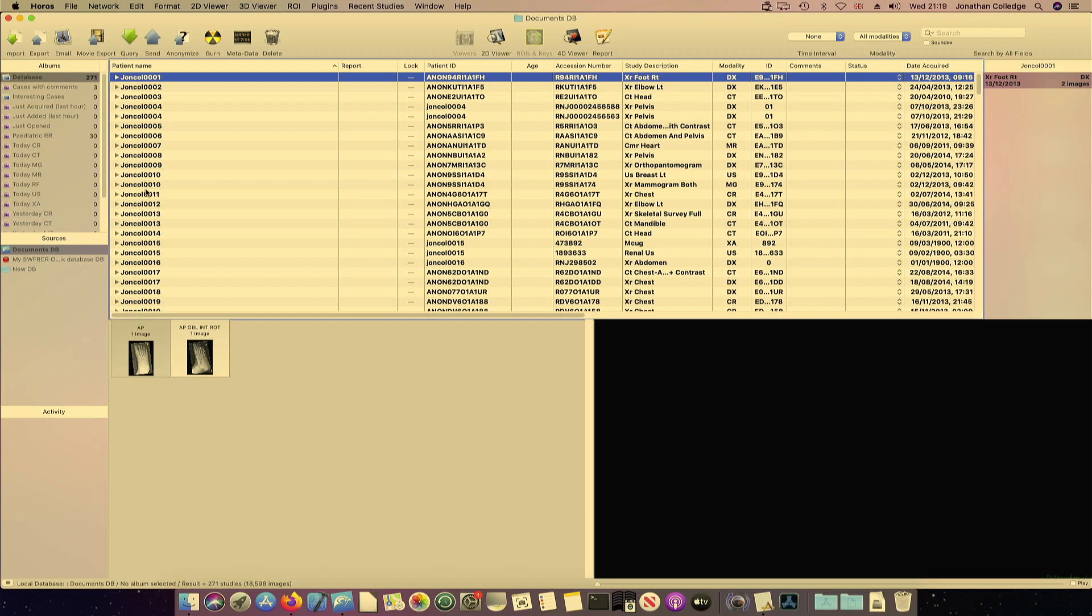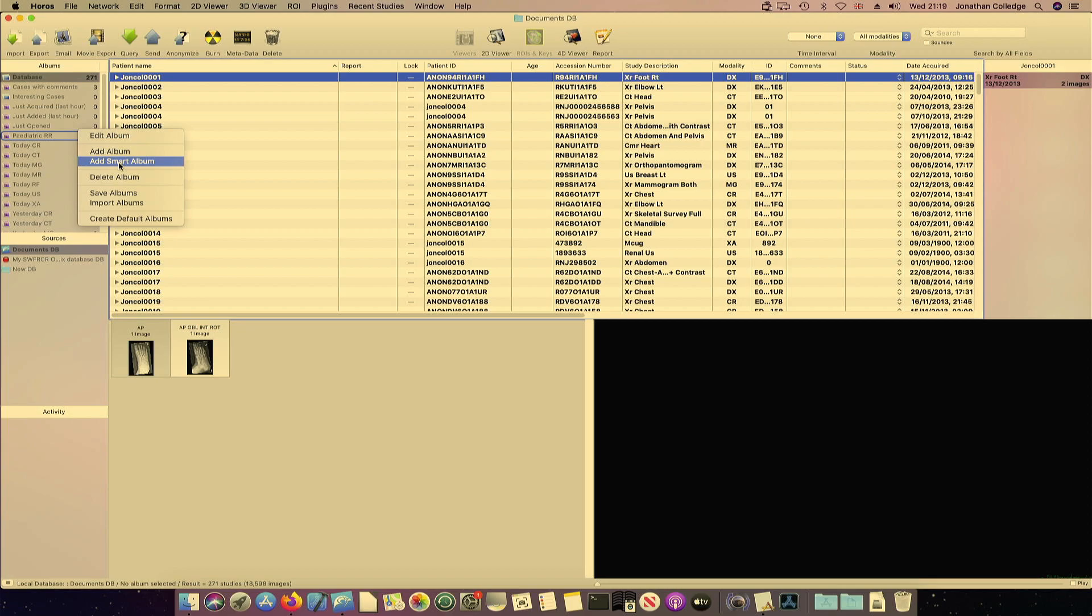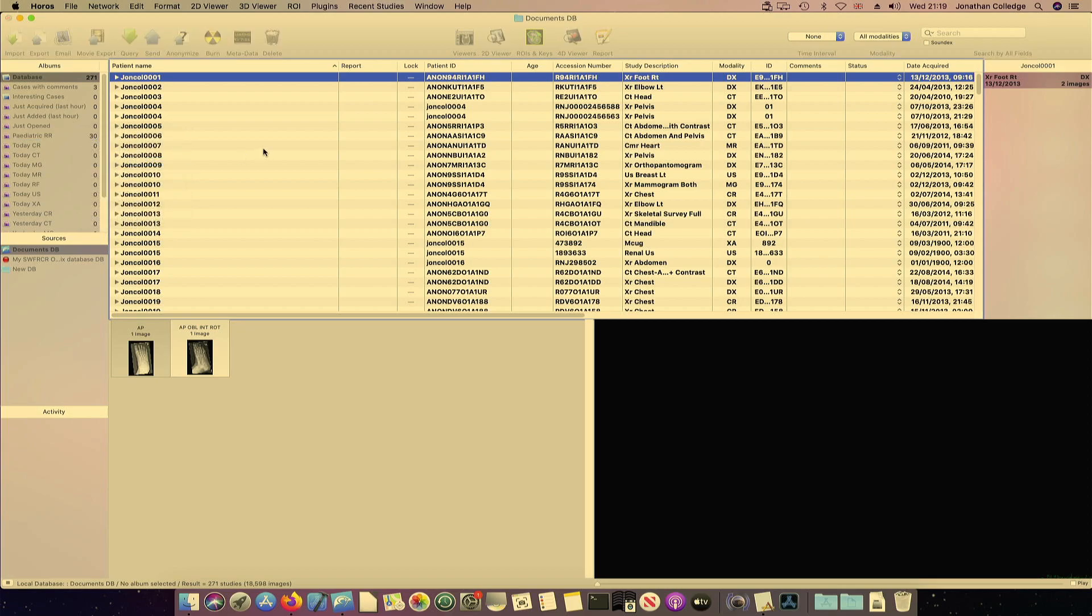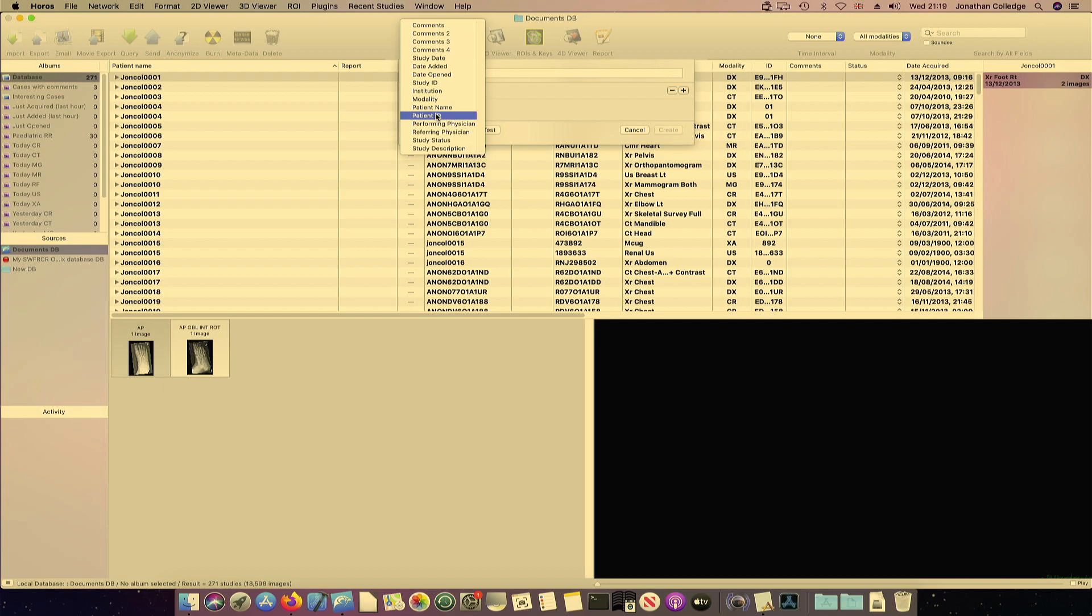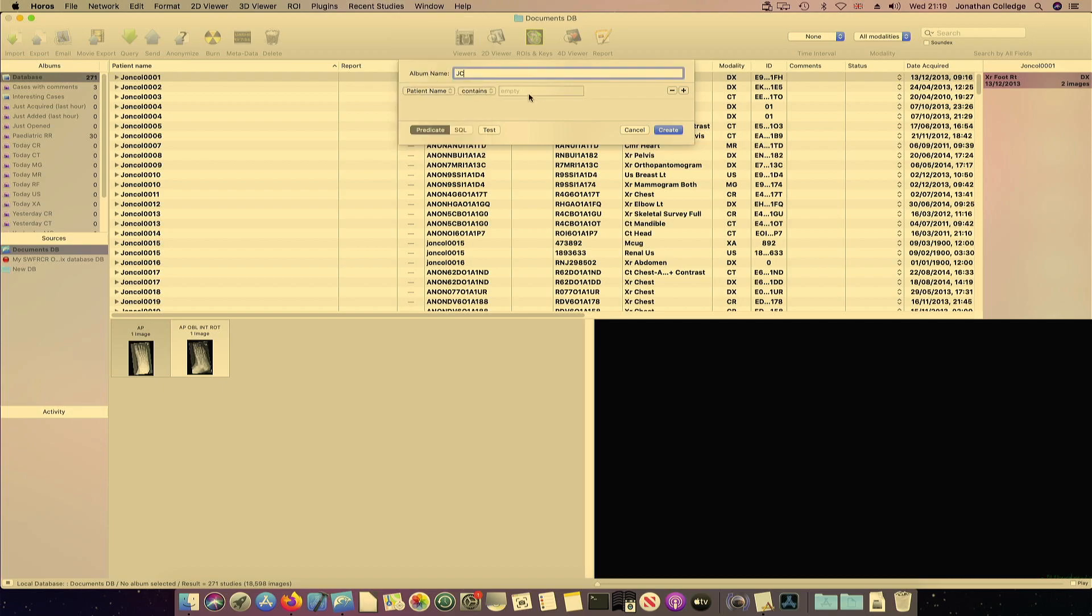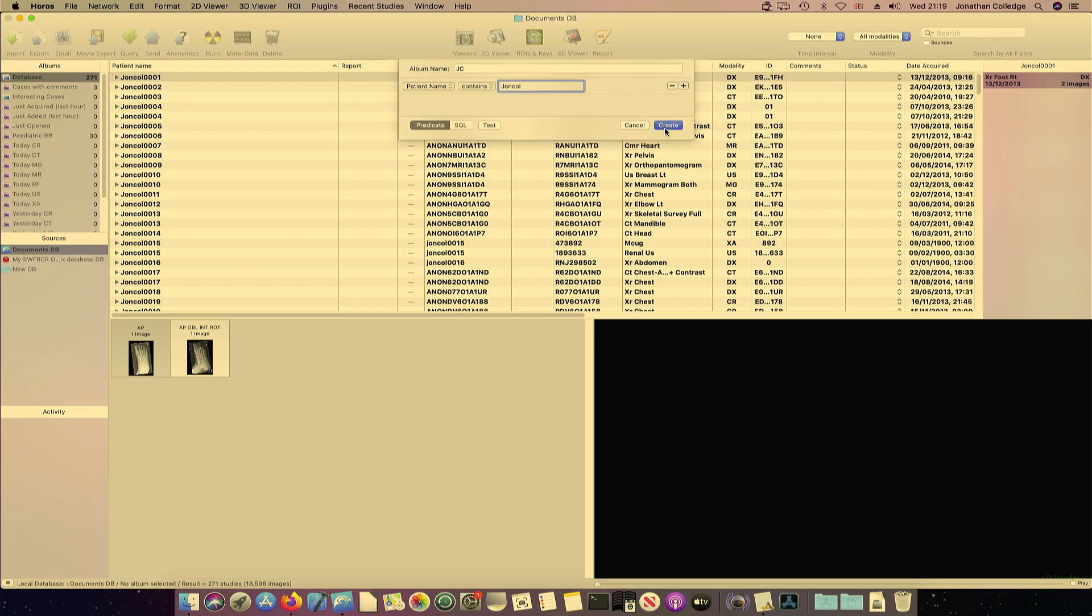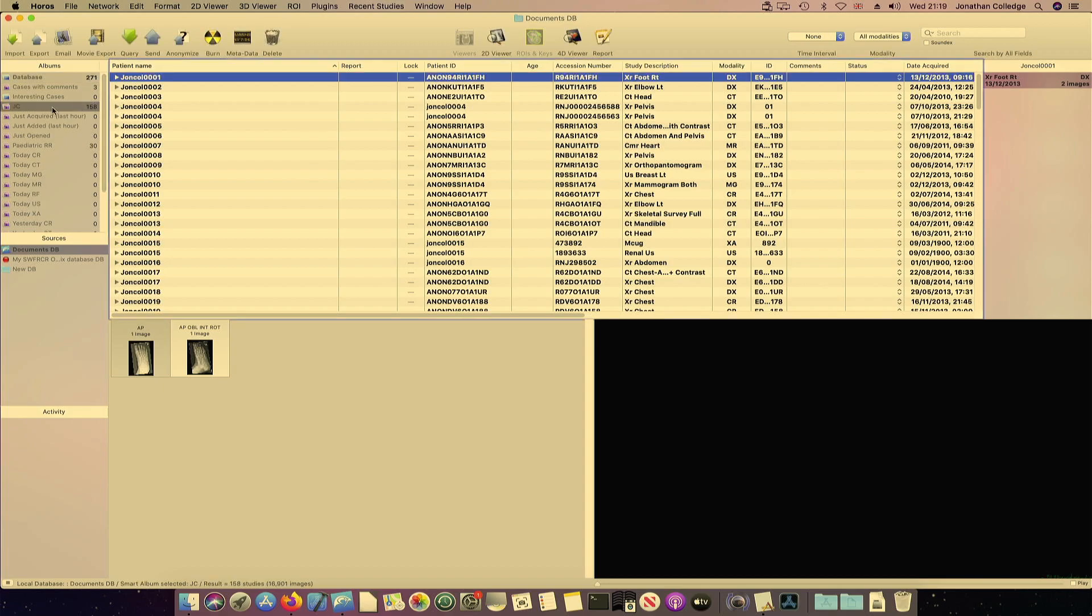And I can create a smart album. So if I just add smart album, I can just label that JC. And if I select a tag, let's choose the patient name and we can add John Colt. So if we create there, I've created an album with all the names that begin with John Colt.